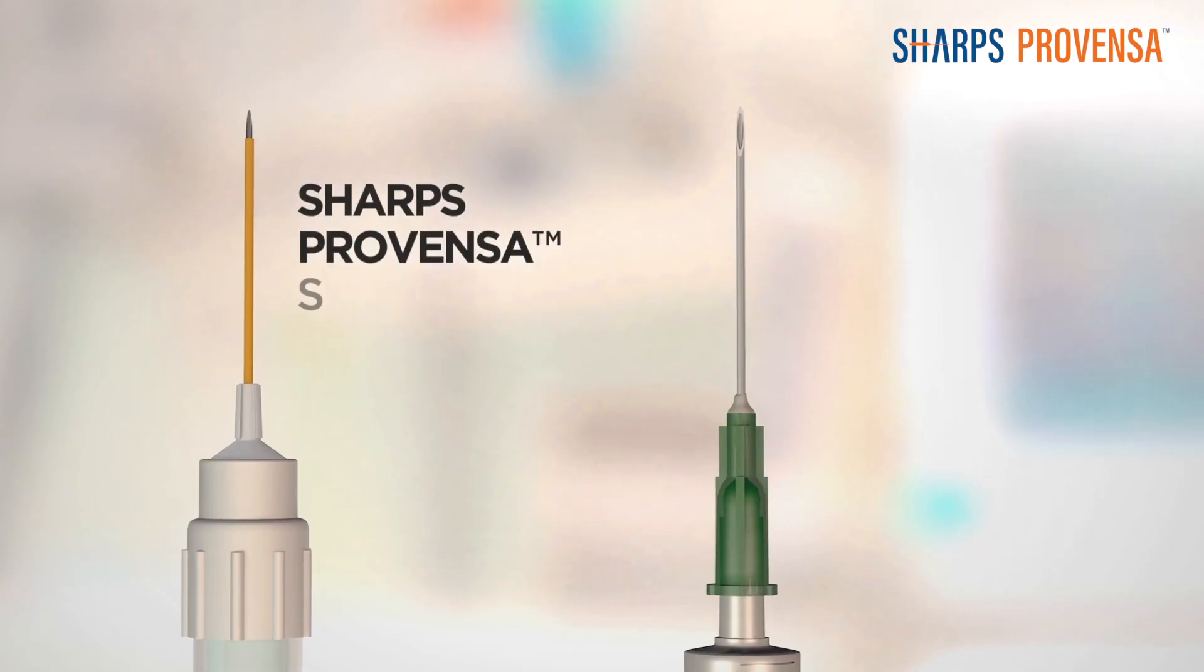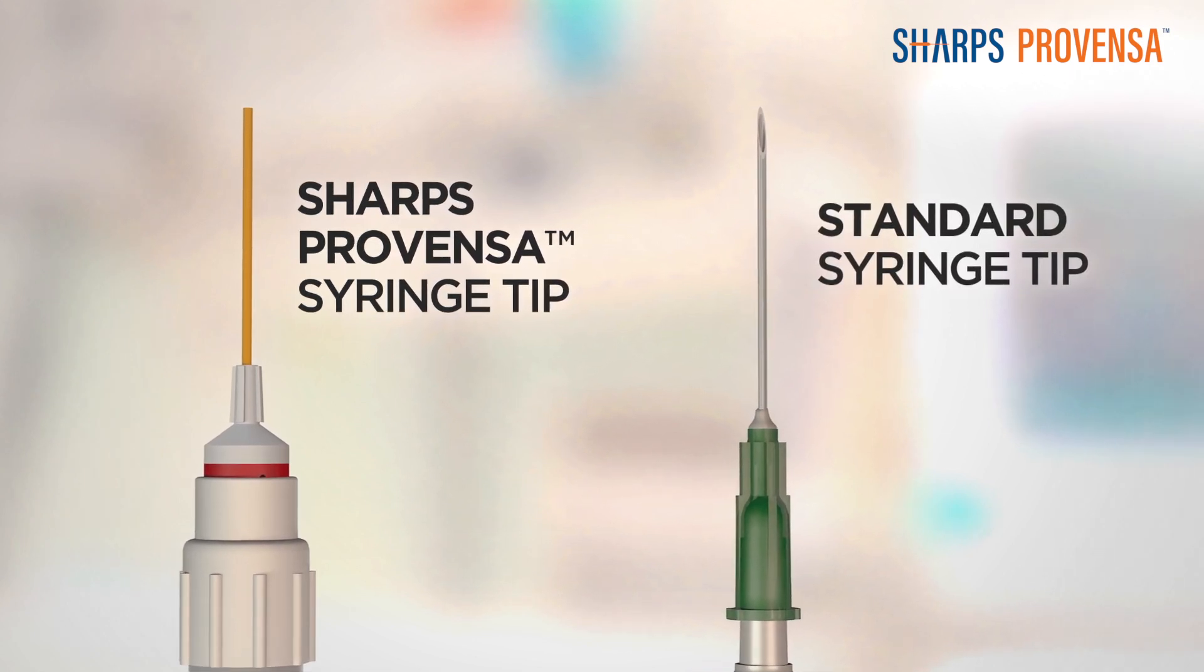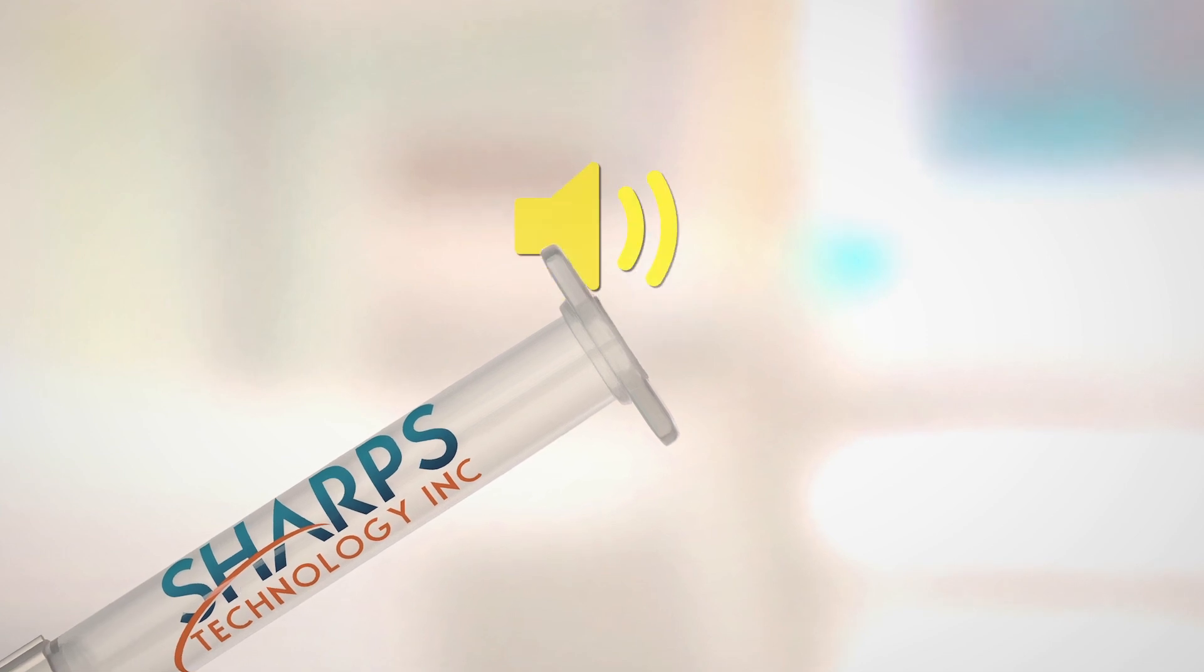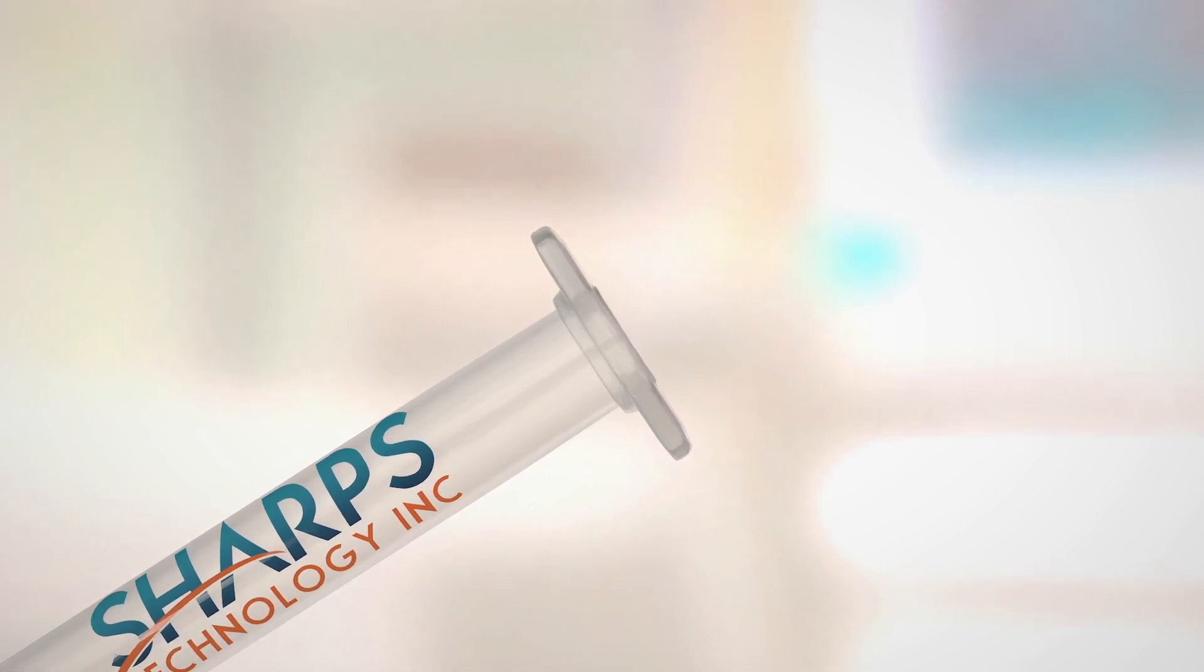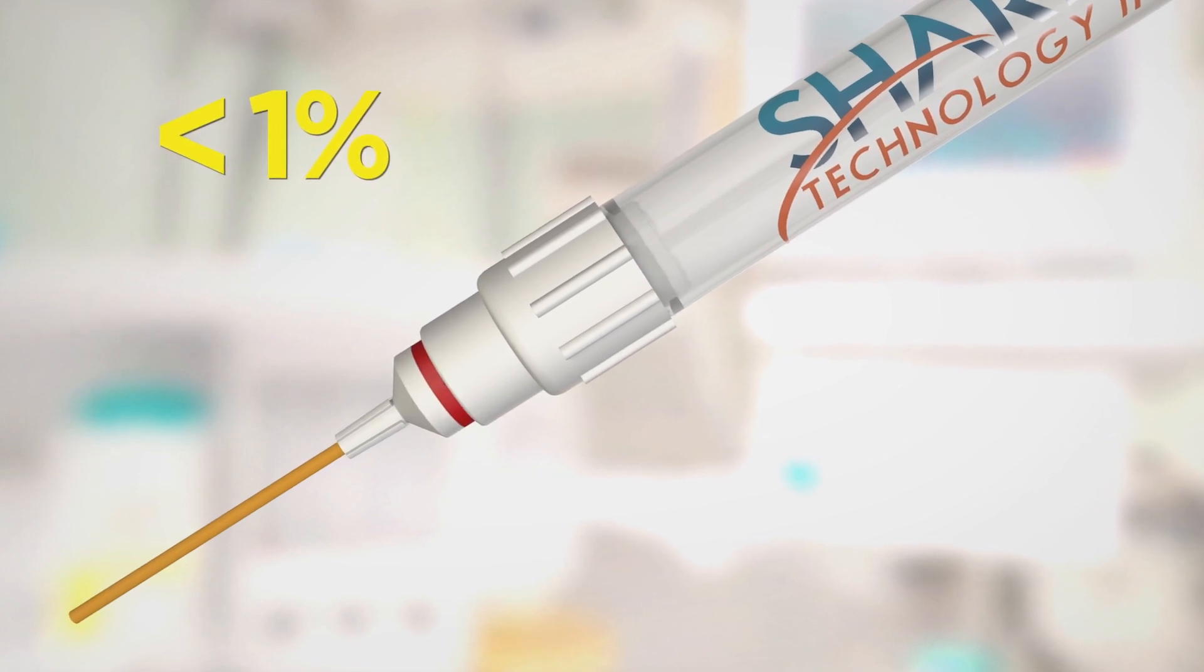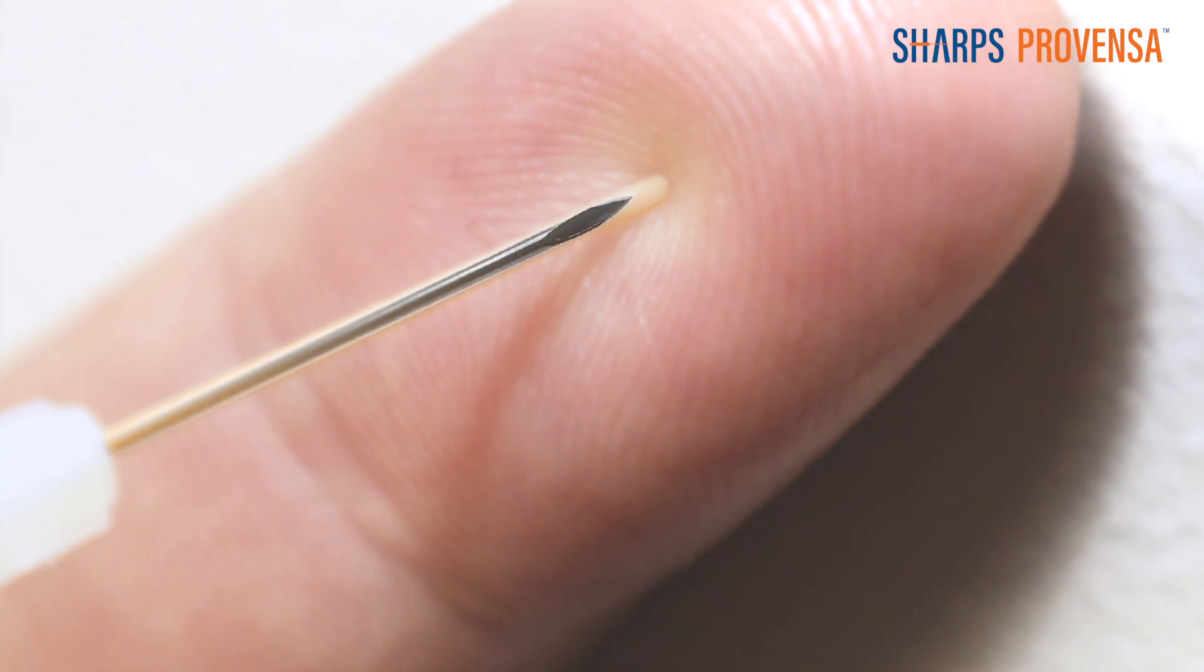Just give the injection and the Sharps Provenza safety shield is activated, covering the sharp needle tip even before the needle is withdrawn. And when the plunger is fully advanced, a locking mechanism automatically prevents the syringe from being reused, and a red line is revealed visually, which lets the administrator know its safety features are fully engaged.